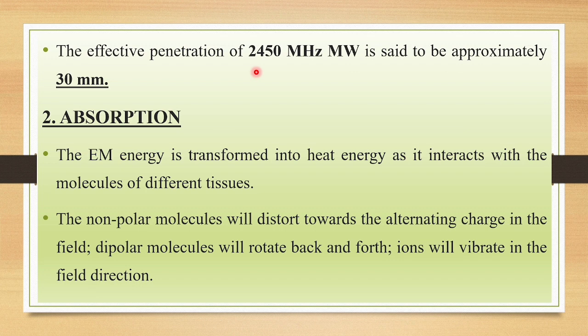The effective penetration of 2450 megahertz microwave is said to be approximately 30 millimeter, that is 3 centimeter. The maximum penetration depth of microwave diathermy is 3 centimeter, whereas the penetration depth of shortwave diathermy is 6 centimeter. So the second one is absorption.